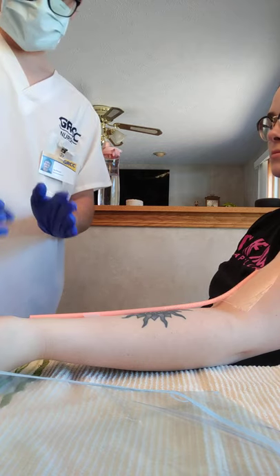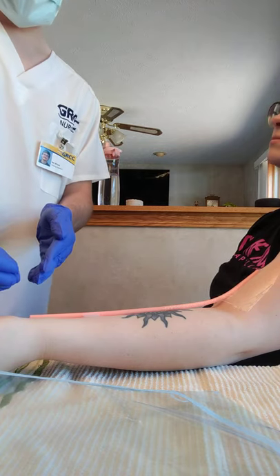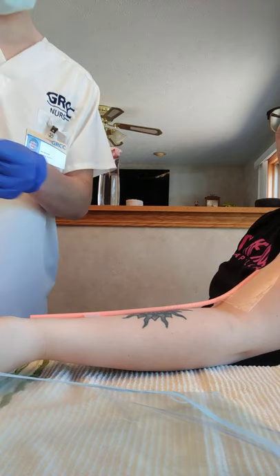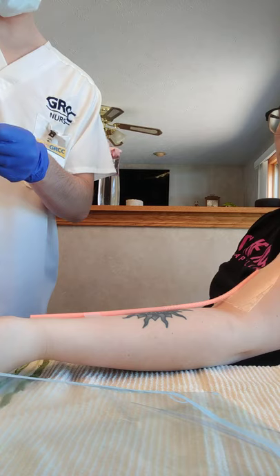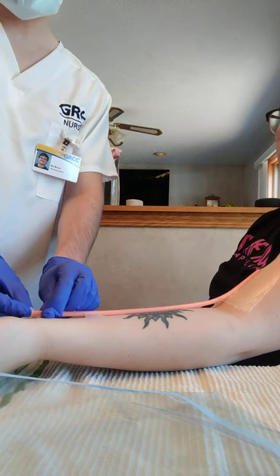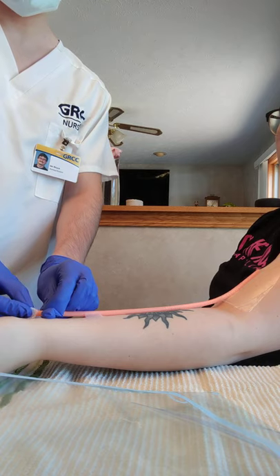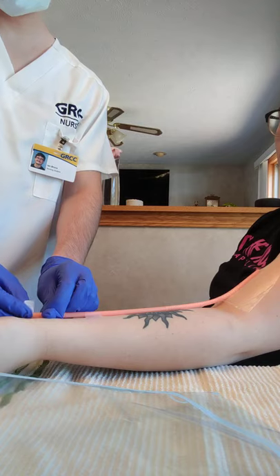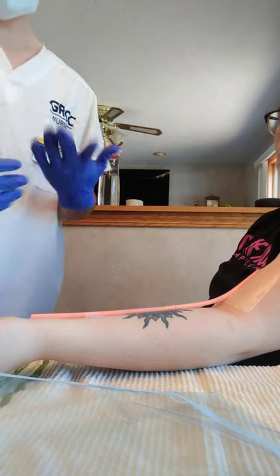Excellent. And now, if there was a port cap at the end of this catheter, I would remove the port cap and I would use a cleaning solution. In this case, I'm going to use an alcohol prep pad and vigorously rub the end for at least 5 seconds, but depending on policy protocol, it could be longer. All right. Now I'm going to let that air dry.